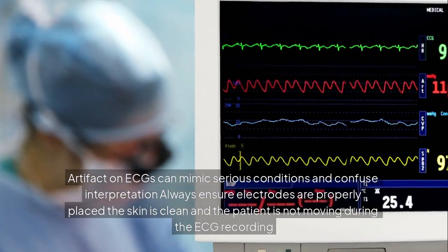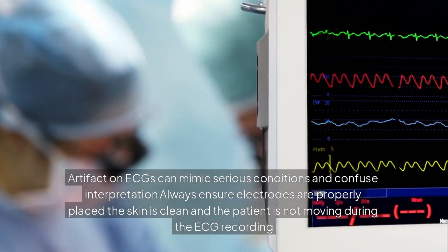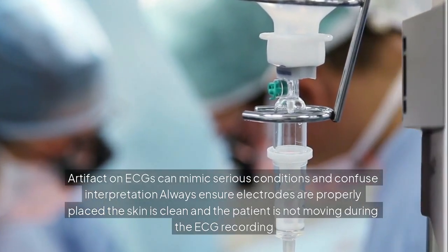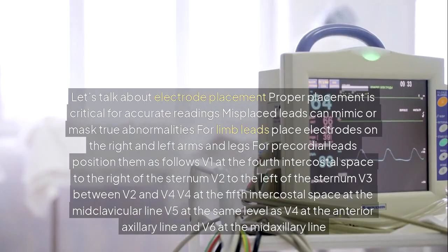Artifact on ECGs can mimic serious conditions and confuse interpretation. Always ensure electrodes are properly placed, the skin is clean, and the patient is not moving during the ECG recording. Let's talk about electrode placement. Proper placement is critical for accurate readings. Misplaced leads can mimic or mask true abnormalities.